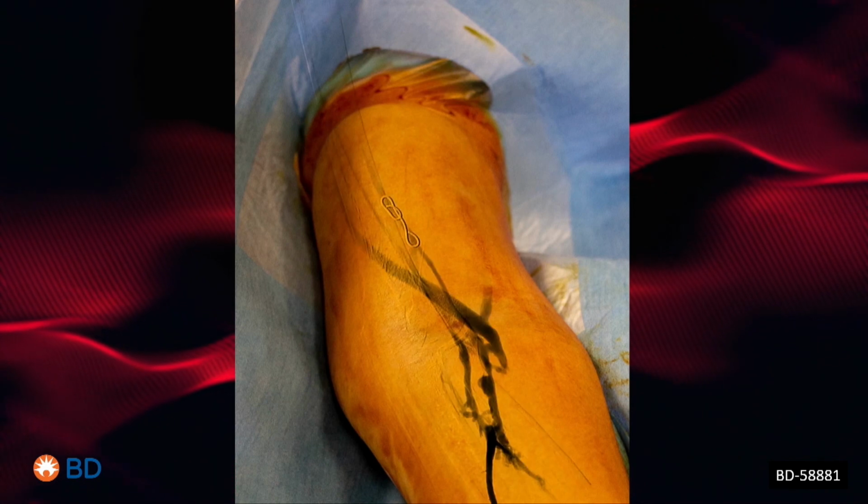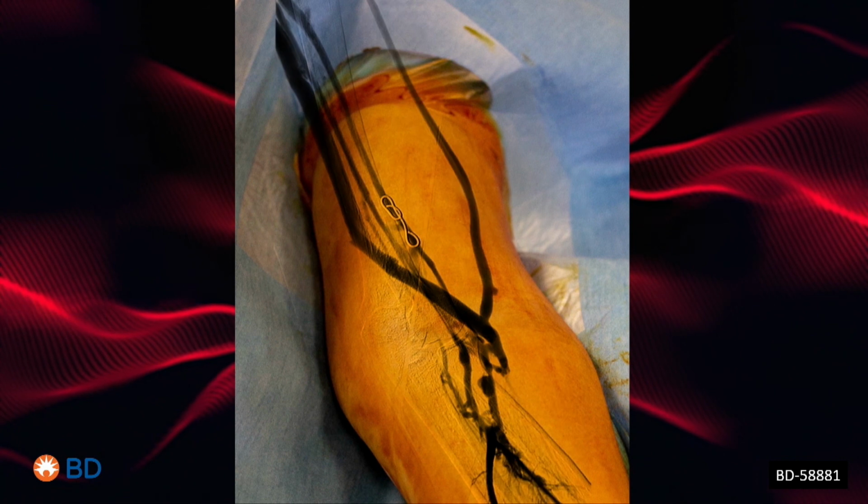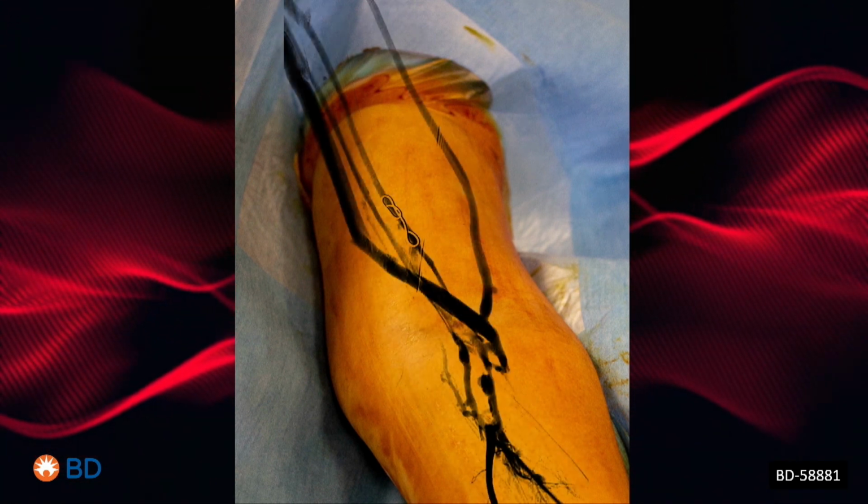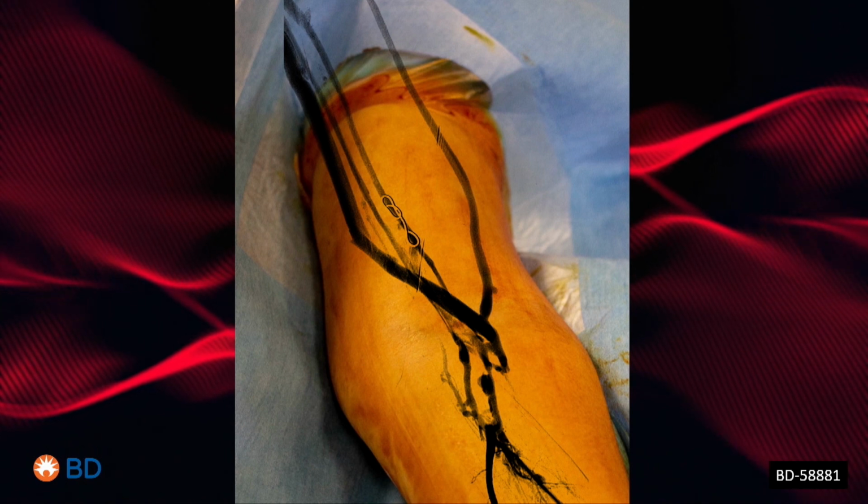And this is what I like because generally I couldn't understand in the beginning. So this is overlapping the fluoroscopy over the hand to get a better idea of how this fistula is created and where it looks. Because people often wonder when they want to cannulate where exactly is the anastomosis. So this is where you should be expecting it.